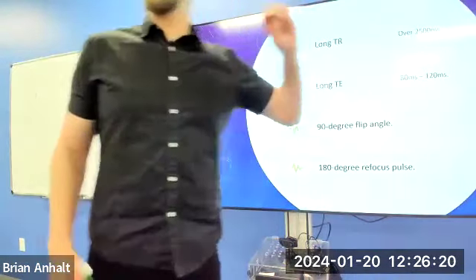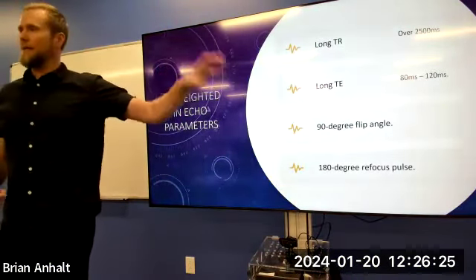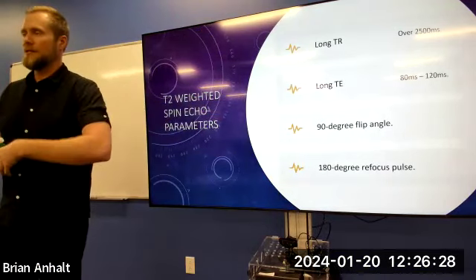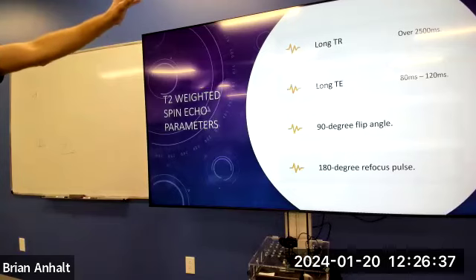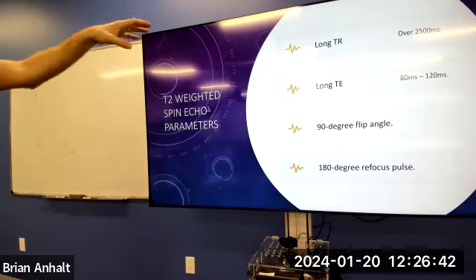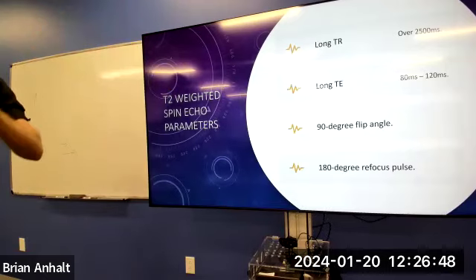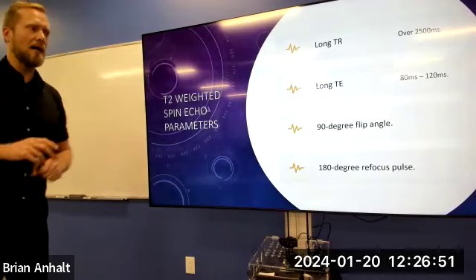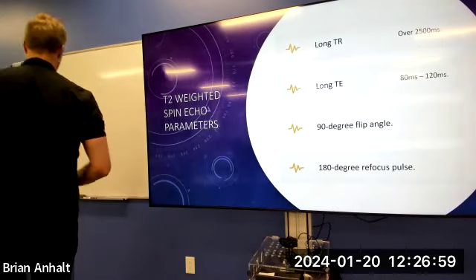It's going to say at the end of the PowerPoint, but these ranges are general and they can vary depending on what you're trying to do, right? But the reason we're memorizing these ranges is so that we can do these exercises and figure out what we're talking about here. So don't take these ranges as the Bible for MRI when you go out into the field. They're pretty decent, but it depends on what you're trying to do. There might be reasons why you want to go outside these ranges, and also different field strengths slightly affect these ranges too. So not a lot, but a little bit. But for our class, these are the ranges that are the truth.